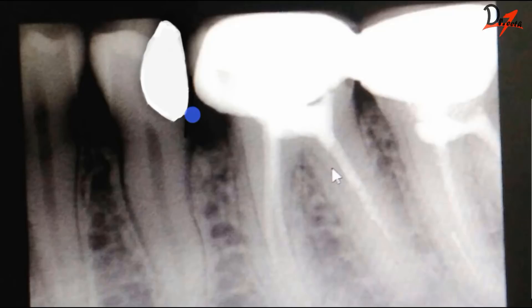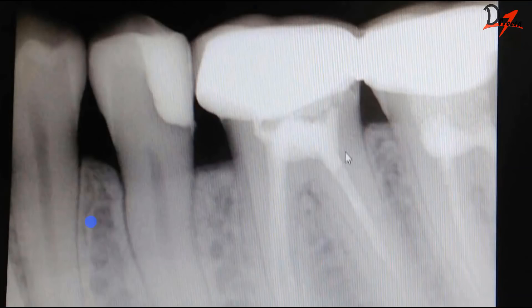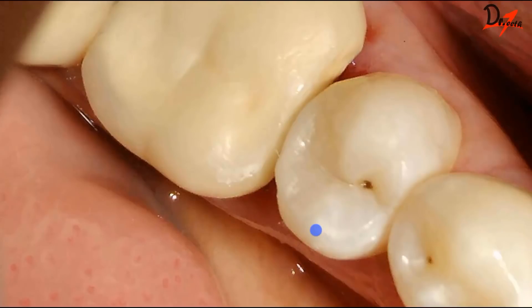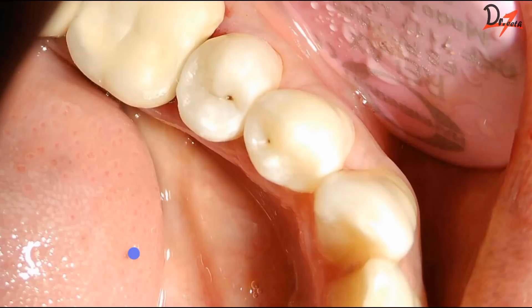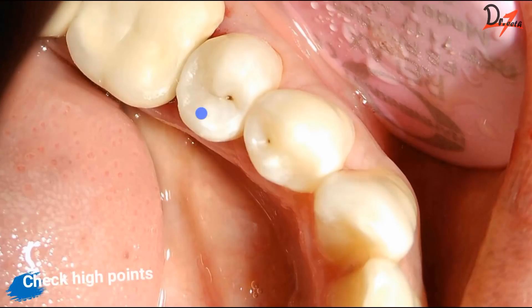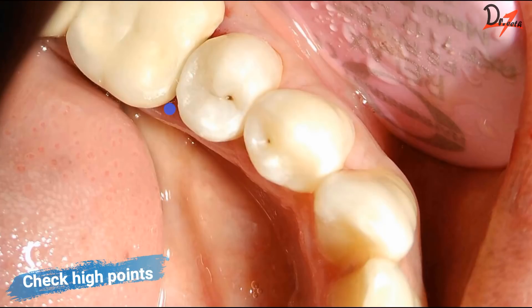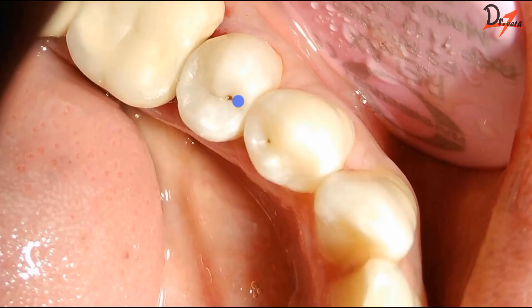Our post-operative radiograph should look like this. Going back to the actual post-operative radiograph — here it is. Clinically, this is what the restoration looked like after completion — here is one more clinical picture showing the finished restoration.